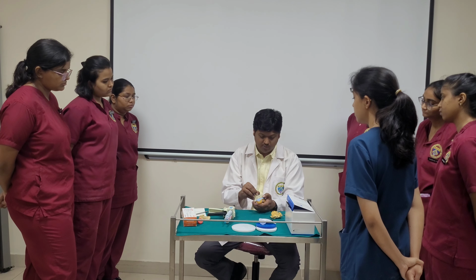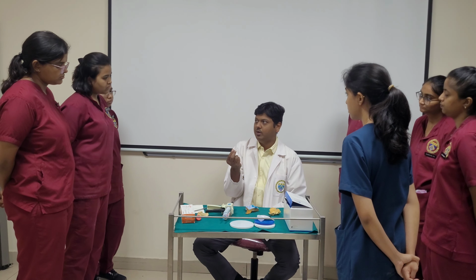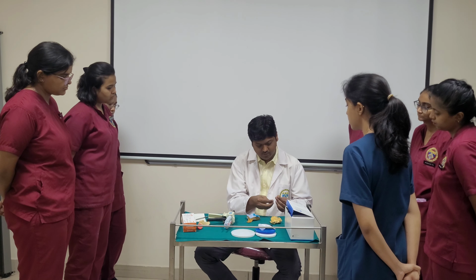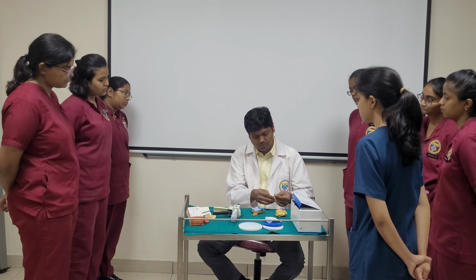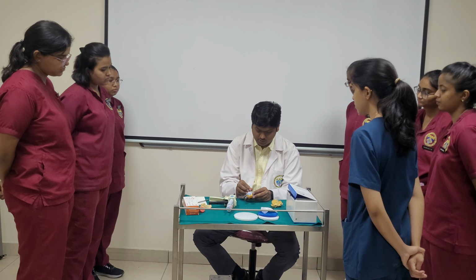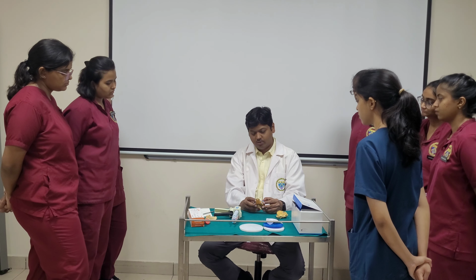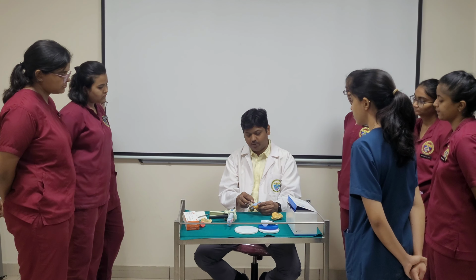Now, before placing it, as I told you, this is the lab analog or dummy implant used for the lab. I will fix this lab analog to the closed impression post, and I will place this impression post inside the impression. Now it is ready to pour the cast. Now we pour the stone, and the model is prepared.